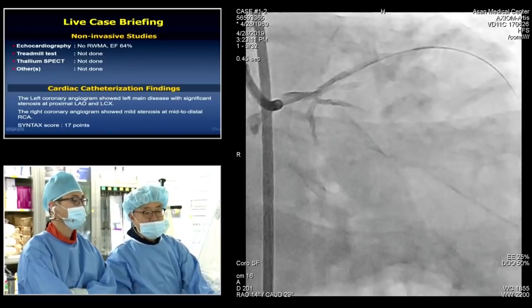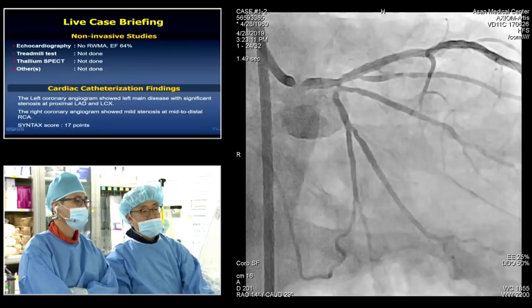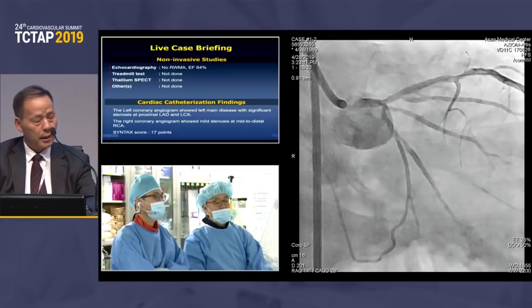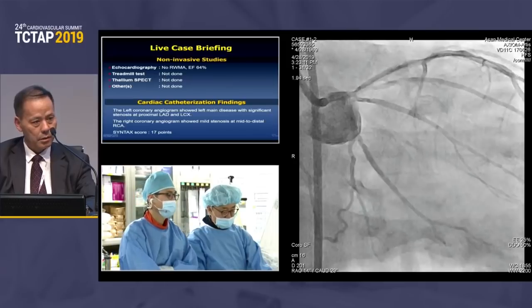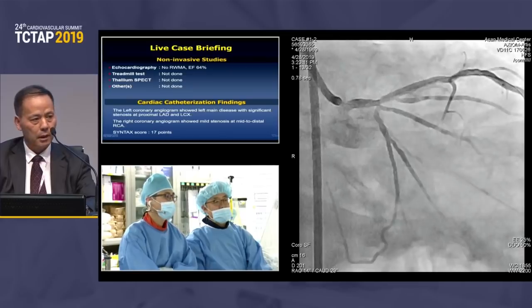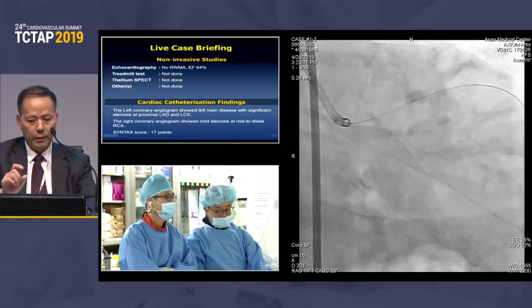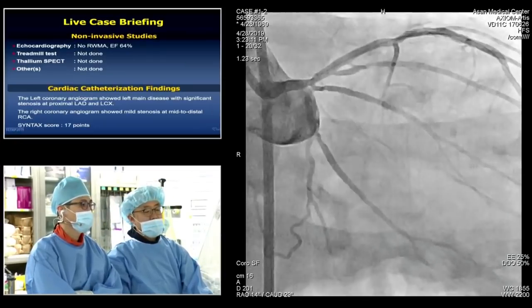Angiographically, it looks like intermediate stenosis at the ostium of the circumflex. Even though there is mild plaque at the ostium, angiographically I don't think it's a good candidate for a two-stent technique because of the relatively low SYNTAX score. So it should be a good patient for PCI. But personally, whether IVUS is used or not, provisional stenting is a pretty good technique. The reason is that it is a very short lesion at the proximal circumflex. IVUS first. Dr. Bang, would you show us IVUS?